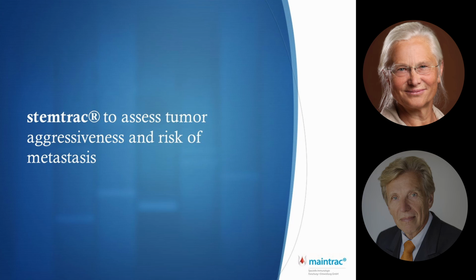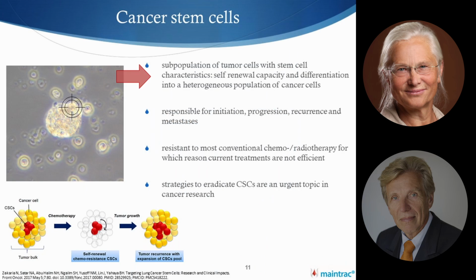So another approach which I have mentioned is the Stemtrac approach to assess tumor aggressiveness and the risk of metastasis. The Stemtrac tries to track cells with stem cell characteristics, which are among the circulating tumor cells and sometimes are only a small population of the circulating tumor cells.